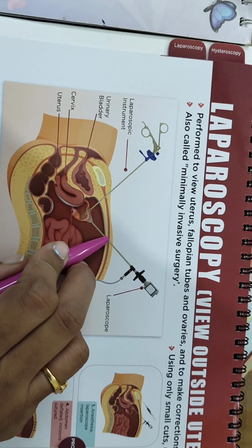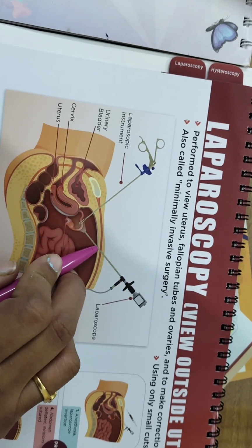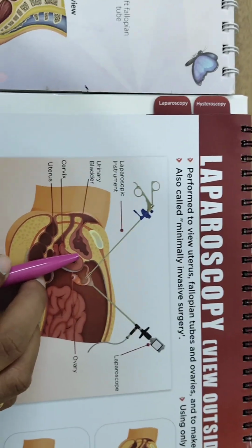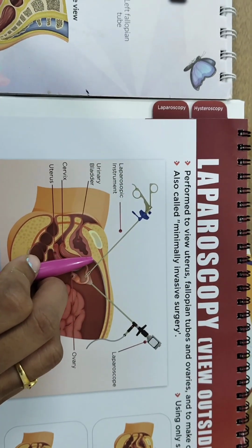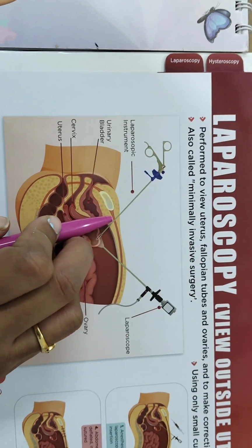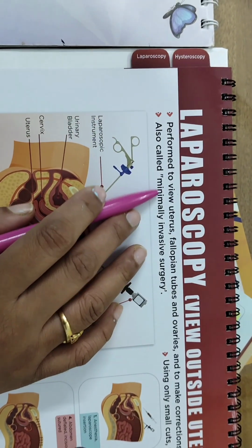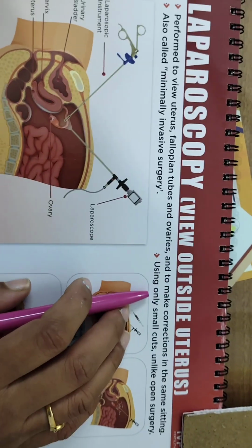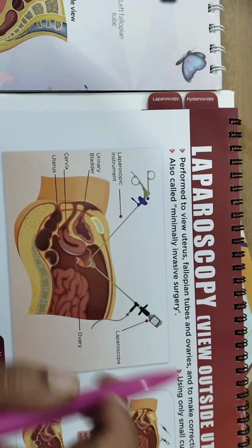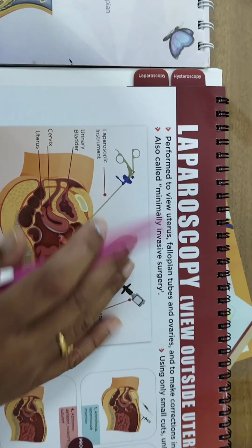Okay, and most of the times if it is made through the umbilicus, even after surgery, even the stitch is not visible, and along with that accessory ports are put through which we put the instruments, and the size is only 5 mm. So 5 mm does not even require any stitch or any kind of suturing for it to close, because it will heal on its own. So that is why it is called minimal invasive surgery. It uses only small cuts, unlike open surgery, and that is known as the laparotomy. Okay, so that is the difference: laparotomy means a big cut is made and laparoscopy means only small holes are made.